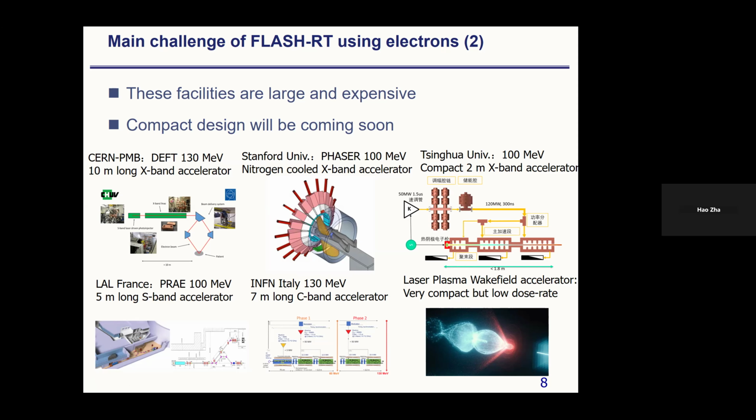So VHE is very promising. The accelerator size and complexity are still a challenge. But I believe that the compact design will be coming soon. For example, at Tsinghua University, we have built this machine in recent years.